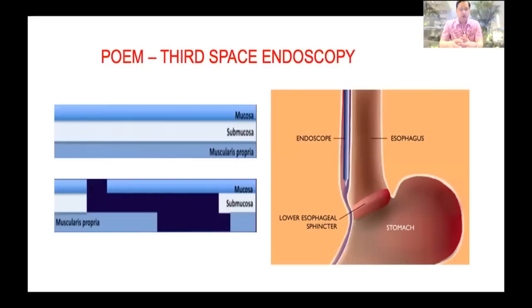In POEM procedure, we should always remember the flap-valve mechanism. The mucosal incision and muscle incision should not be in the same line. After making the mucosal incision, you have to enter the submucosa, expand that space, dissect all the loose areolar fibers to reach the lower esophageal sphincter where the muscle is to be cut.